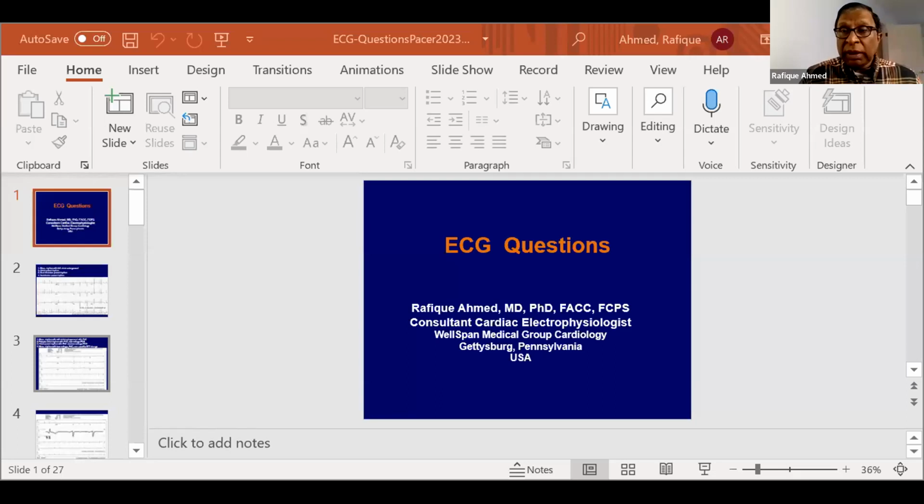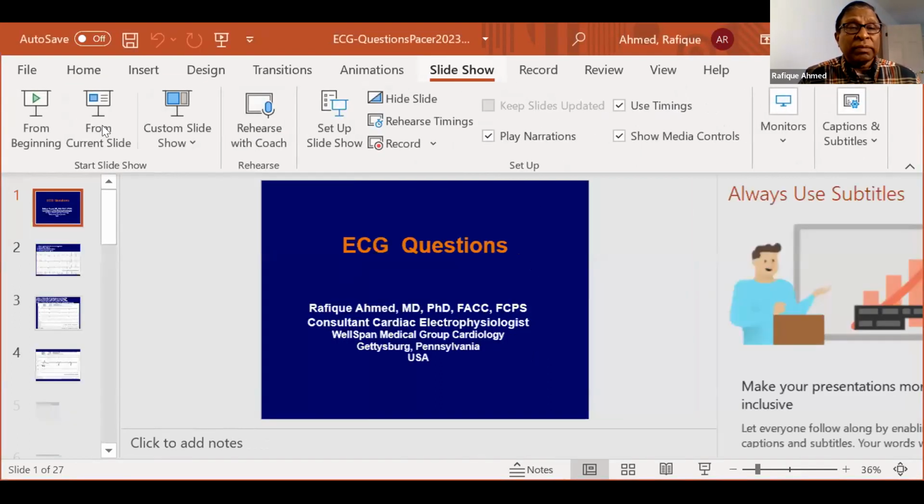Sure. So I'll show some ECGs. I thought that today I'll show pacemaker ECGs. I didn't keep relevance to Naharuma's talk. Of course, that's a difficult topic for me also. Naharuma, thank you. This is a good field, not only for the young cardiologist, even for us. It's always good to learn things. And remember one thing, that learning and then keeping the knowledge is also important. It doesn't matter how much we know, if we don't keep looking at it and practicing it, it goes away. Yes, sir.